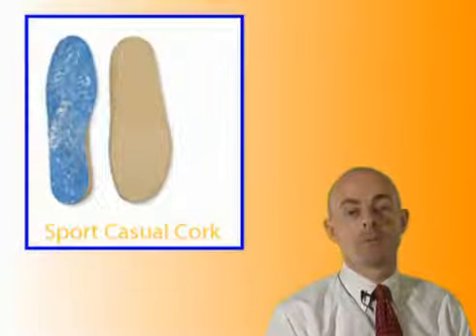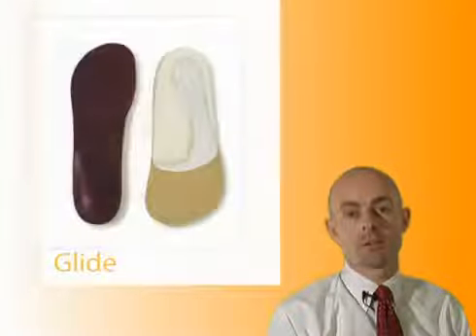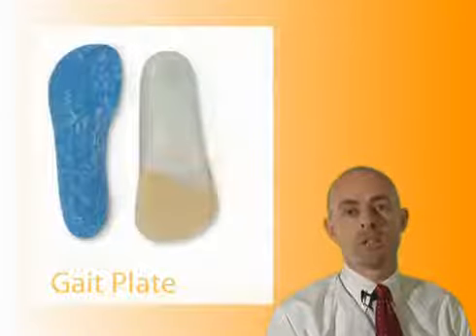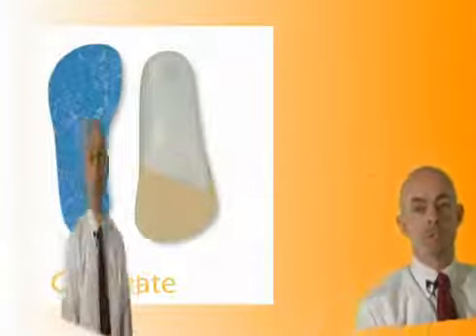extension. The flexible extension can be made out of cork, EVA, or any other suitable material, usually 1/8 to 1/4 inch in thickness. The goal of the flexible Morton's extension is to bring the ground up and increase the weight bearing along the first MPJ.